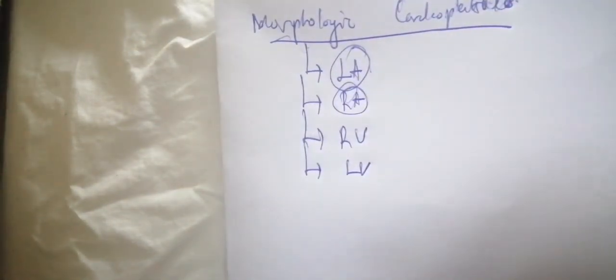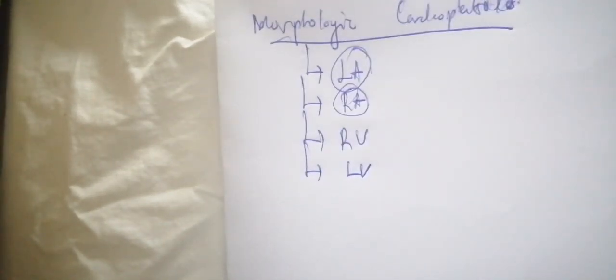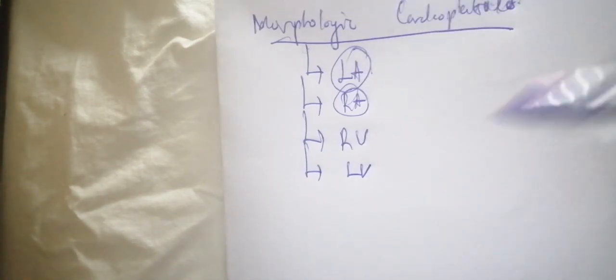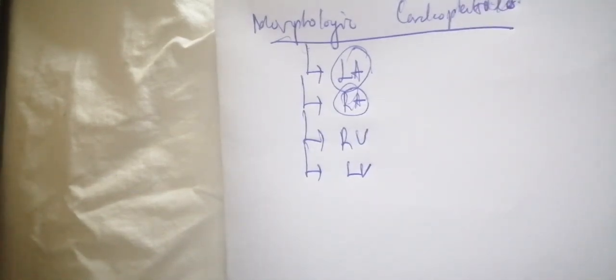Now, we need to know that left atrial enlargement and right atrial enlargement are signs, these dilations particularly show that the patient may have heart failure. Particularly, left atrial enlargement may show heart failure, or it may also show hemodynamic abnormalities, particularly valvular heart disease. You can have a left atrial enlargement in case of a mitral regurgitation that you can visualize physically, and other pathologies. You can also have a right atrial enlargement in case of a tricuspid regurgitation.